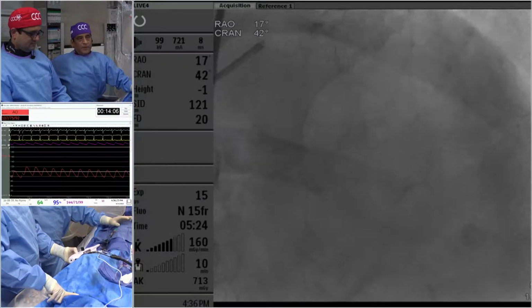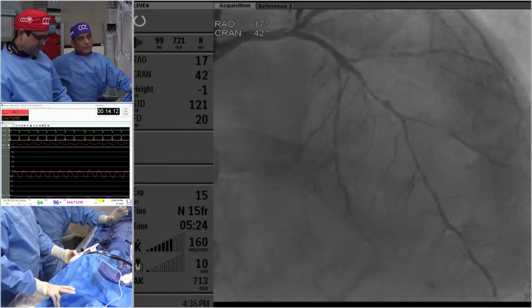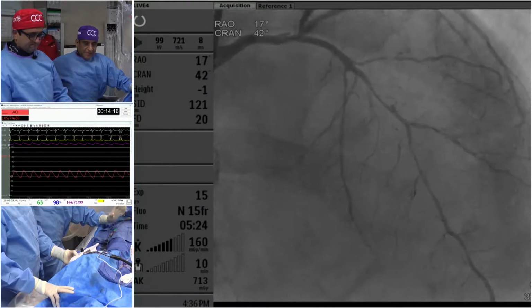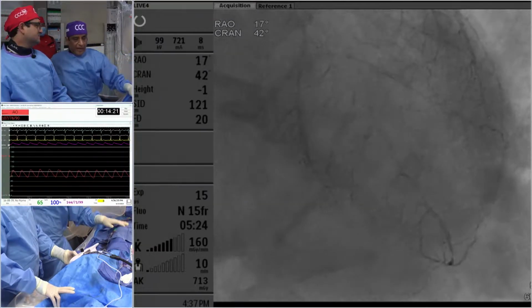So what is the purpose? What do you want to do with atherectomy in these kinds of cases? Well, I would say one of the reasons is that the patient has multiple branches. We want to have less plaque shift. Secondly, you make an IVUS-guided short stenting. You don't put a stent from there to there. You know that has very high restenosis.